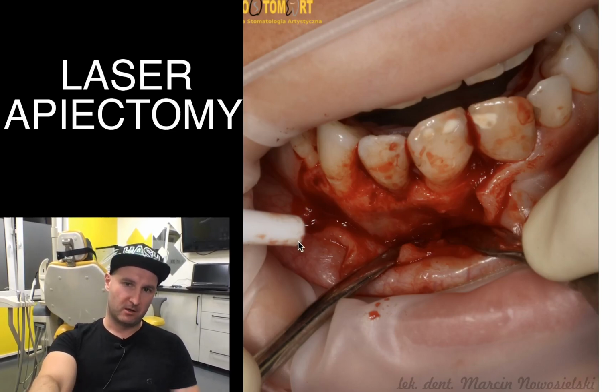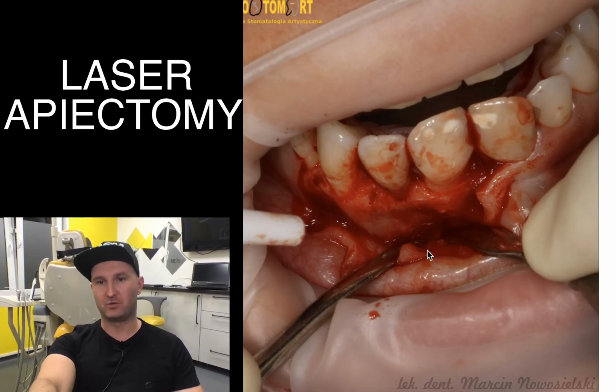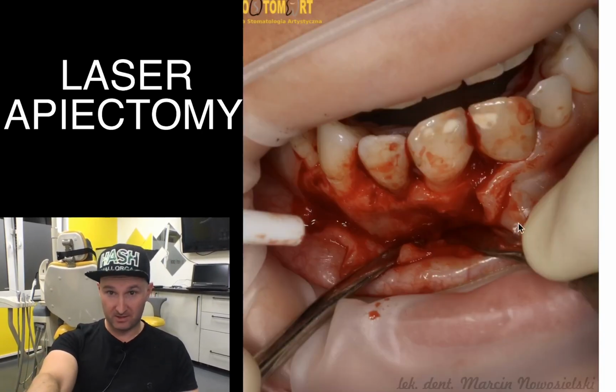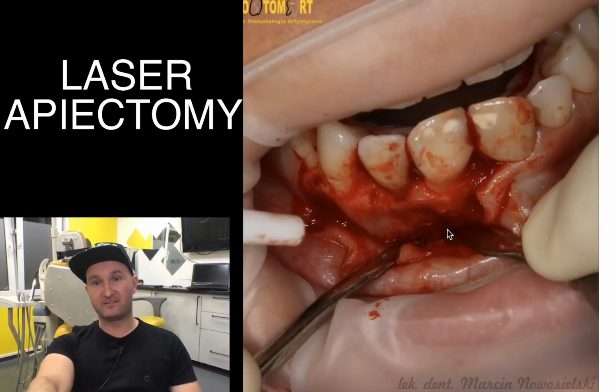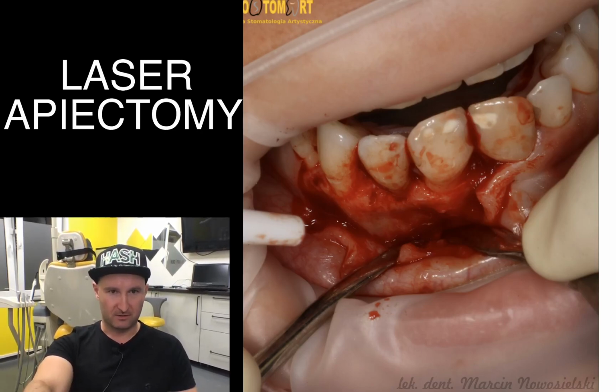After that we opened the flap, it was a full thickness flap, and we were able to see all the operated area very well. The next step in this case was to perform apicoectomy, and this part is recorded. I got it recorded on the video, and now I will show it to you.